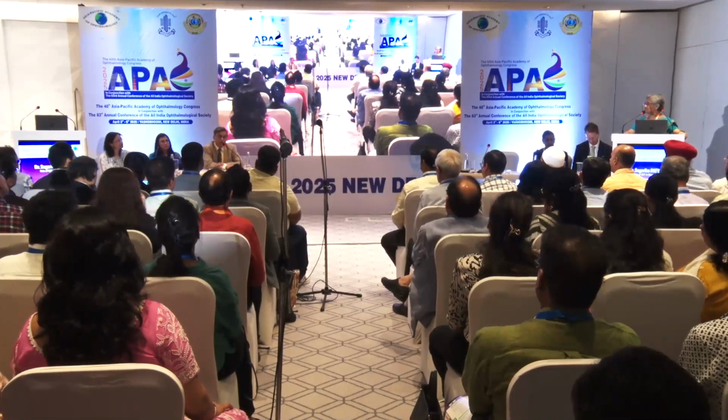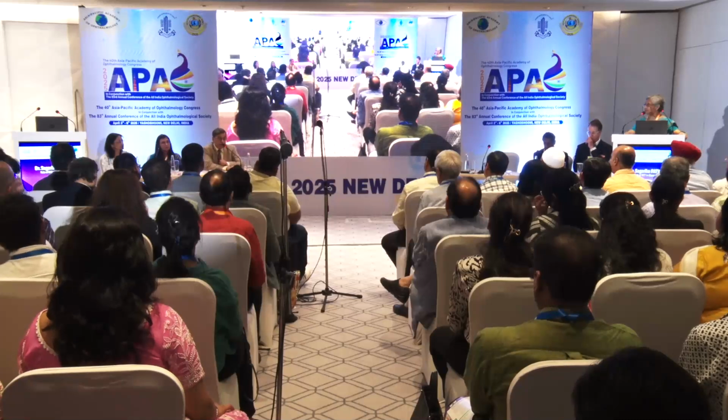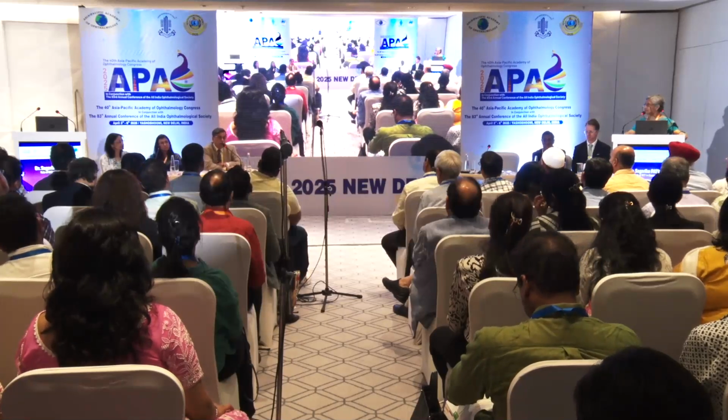I think one thing should be clear. While we stress on OCT with retina, remember, the retina will destroy the macula and the central field. The glaucoma will destroy the peripheral field if you are not careful about that, and if you miss glaucoma in the presence of a retinal disease. Absolutely. So I consider it equally important that when I'm evaluating a patient for macula, I should also make sure I don't miss the glaucoma. And the OCT for RNFL is an important part of my workup for retinal disease also.